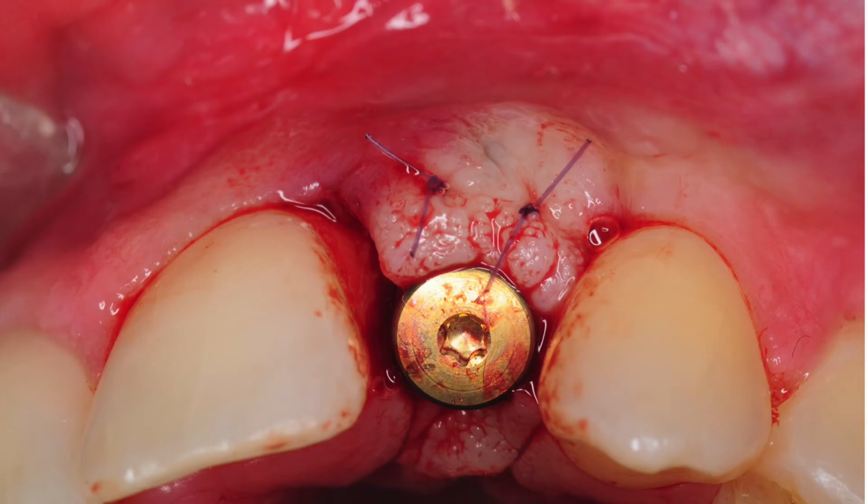Right? So 4 months later, we do an uncovery of the implant. This is a palatally based incision to bring some of that keratinized gingiva and some of the connective tissue that we have there and roll it toward the buccal. You're a Penn grad. And this is where you take over. Yes, and another Penn grad, Arnie Weisgold, a master.